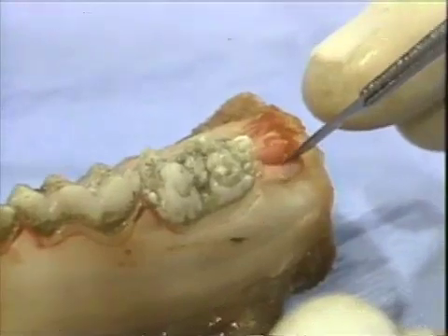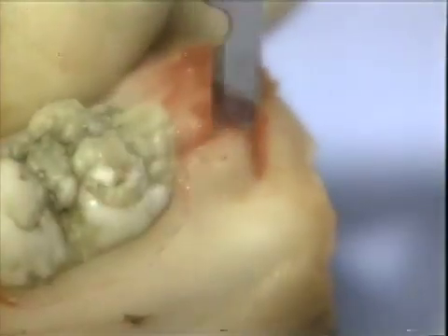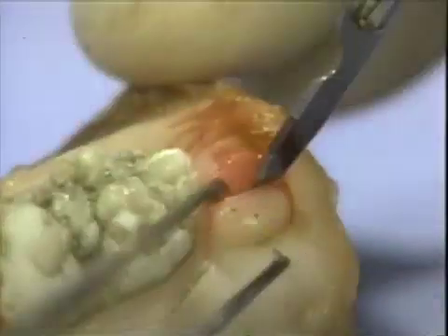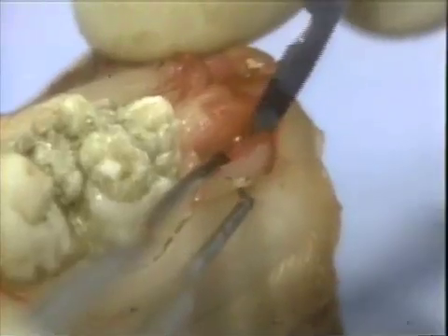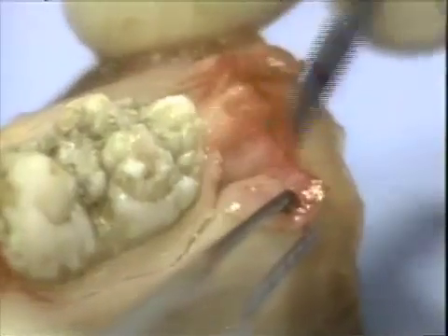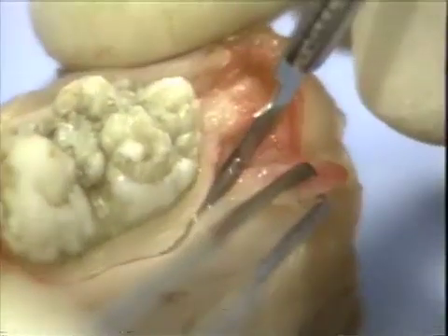In a similar way, tissues lingual or buccal to the distal wedge can be thinned during early flap reflection. The scalpel blade angle is changed so that the gingival tissue is undermined during these early incision procedures. The dental assistant can gently reflect the flap, and as it is placed under light tension, a sharp gingival blade can undermine the flap down to underlying crestal bone.